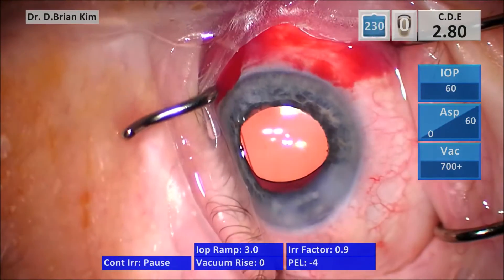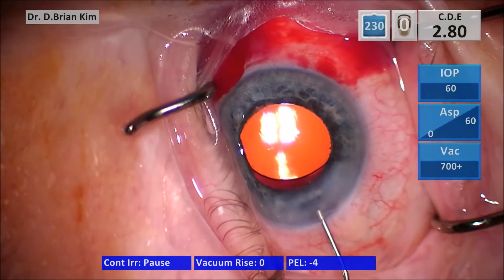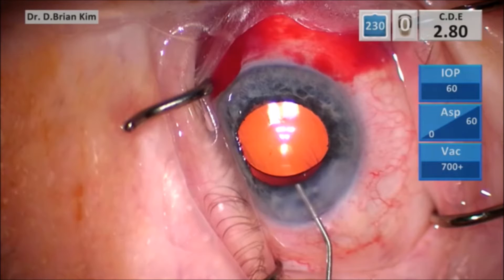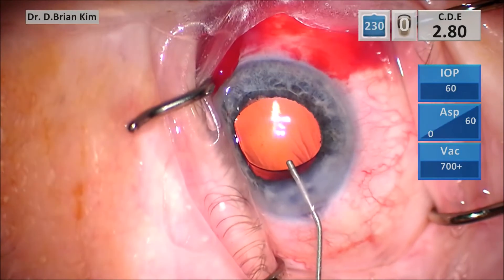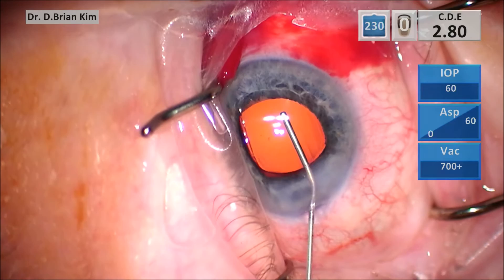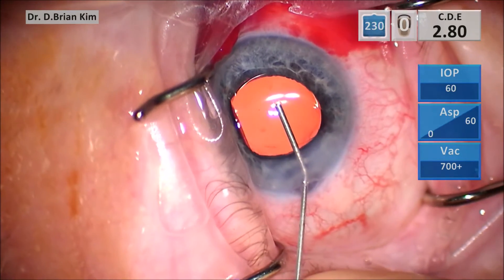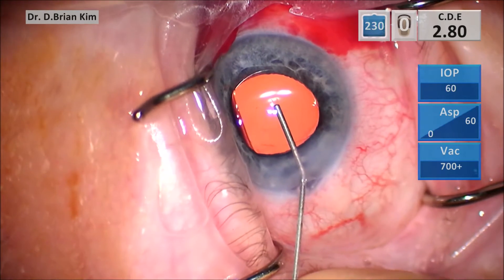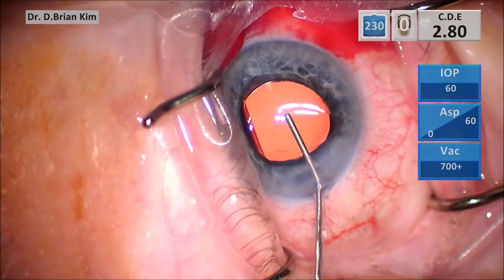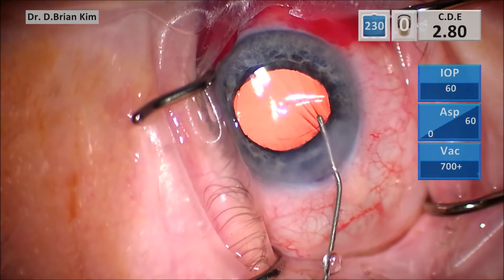After completing the case, you want to go in with the BSS cannula and go under the optic, pushing BSS during this entire maneuver of prolapsing the optic above the anterior capsular opening. Make sure the cannula is against the optic the entire time, then tease upward and towards you so that you're able to prolapse that optic. Push BSS and tease that optic with the cannula towards you and upward.